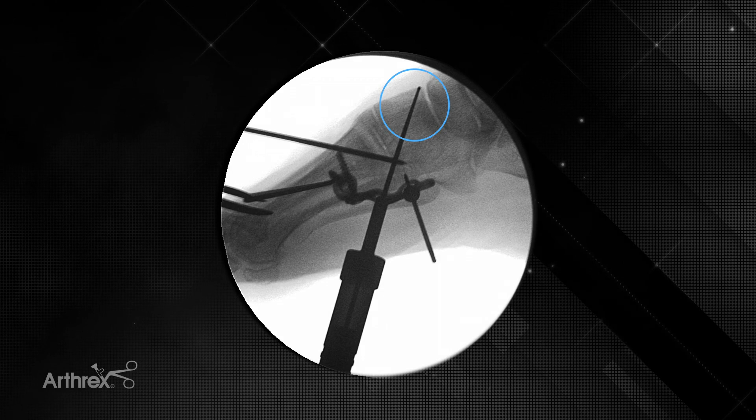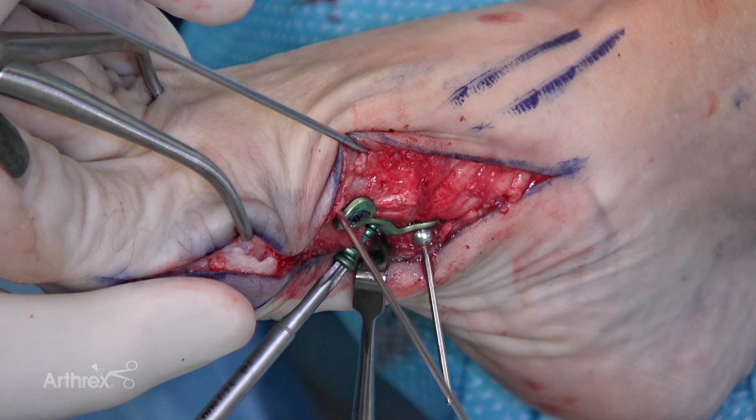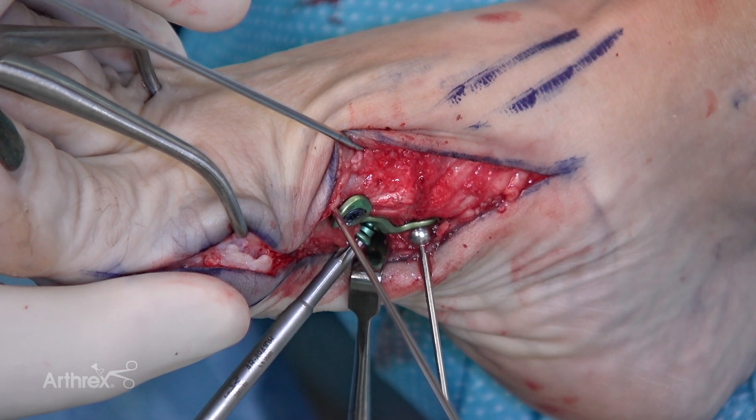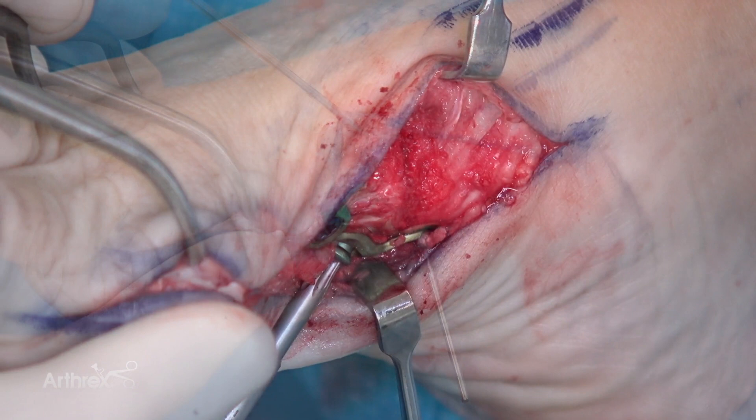That's reading a 42 — we're going to get maybe two millimeters of compression, so let's put a 40 in, and if it ends up being too long we can switch it out. As I advance the compression screw, I'll get right down close to the plate, but before the head starts to engage the plate itself, we'll stop. We'll take our BB-tacks out and our temporary fixation pins out as well so they don't block our compression.